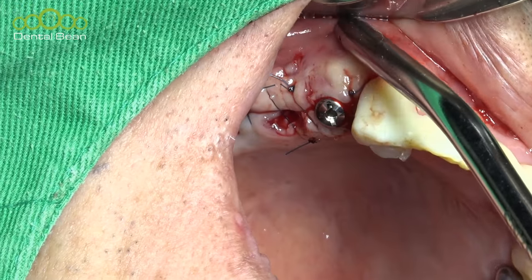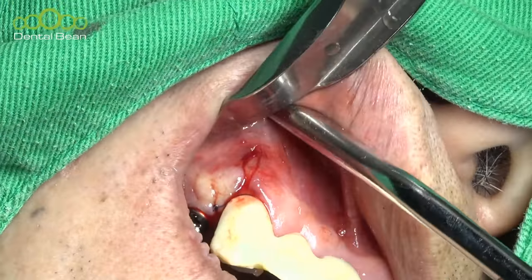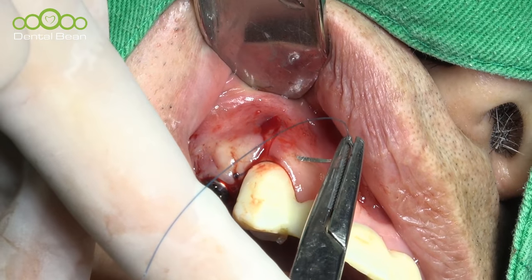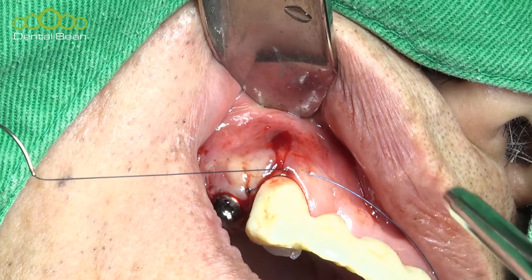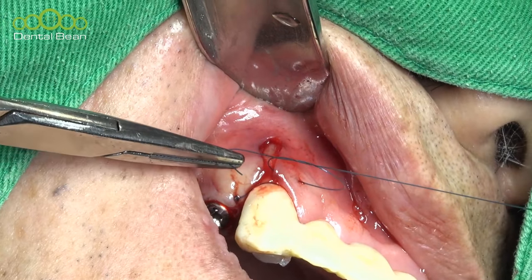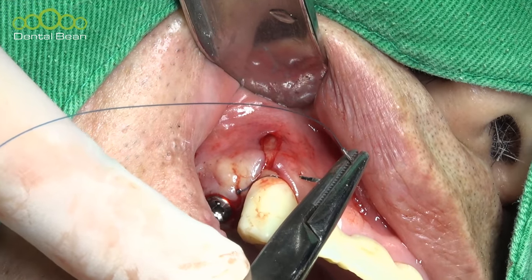Okay, finally, vertical incision. Usually for vertical incision, three sutures is good. From the mucogingival junction, below and superior, upper and lower. The gingiva is very thin, so very careful needle entering is necessary.